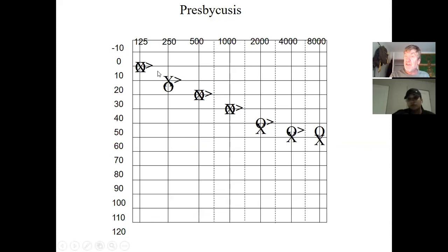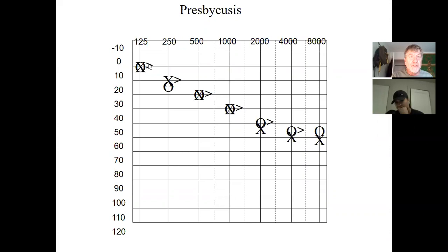Bass is decent. So this person now, when they take off the headphones and they put a bone oscillator, a little headband around the person's head, feel the bone behind your ear. That's called your mastoid bone. They put a little box on your mastoid bone attached to a headband, and they deliver tones through that way. And when they deliver tones through that way, look at that, the hearing didn't get any better. See these hatch marks? That hatch mark here and here? The hearing didn't get any better.